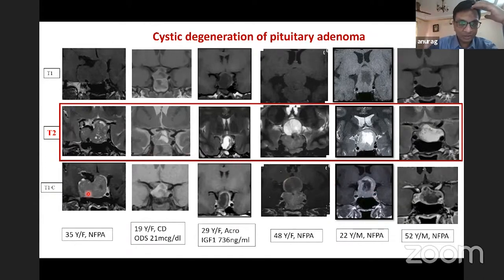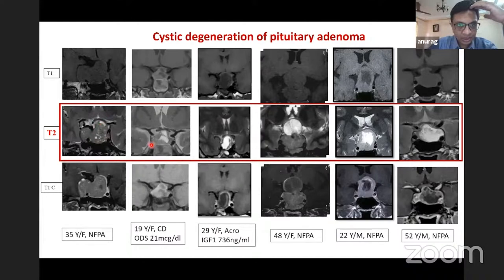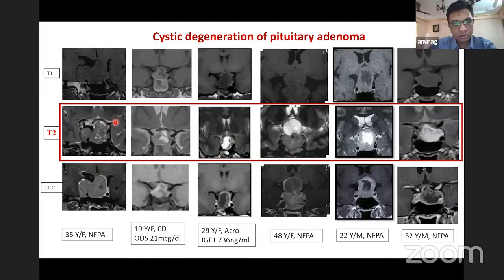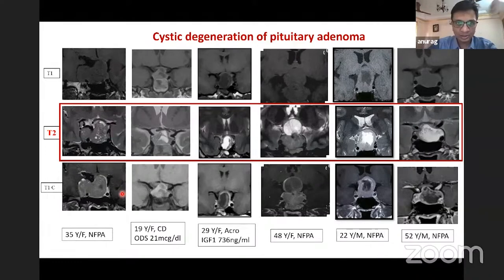Tumors also undergo cystic degeneration over time, best recognized on T2 images in various functional and non-functional tumors. Patterns include micromulticystic, larger multiple cysts, coalescent single cystic appearance, superior or central cystic components, or most of the tumor becoming cystic. On T1, this is a mirror image, with hypoenhancing areas on contrast.